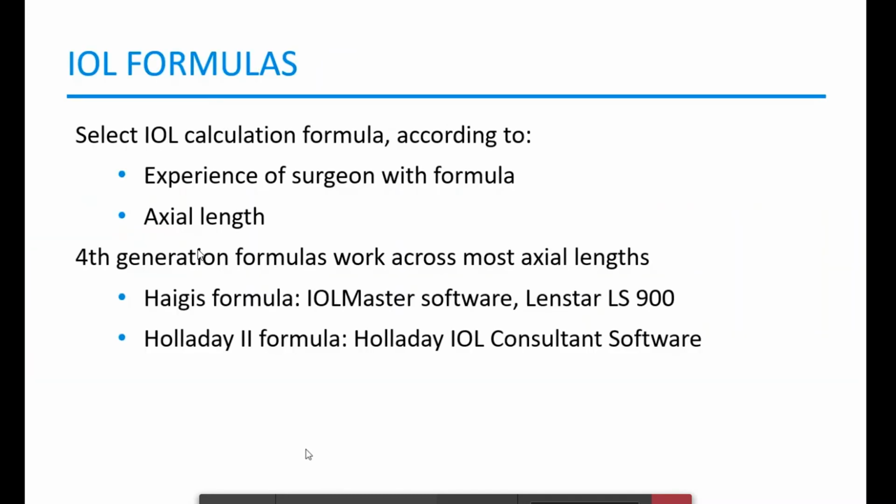So let's take a look at the formulas then. What are the formulas that are being used for calculation? The selection of the IOL calculation formula really depends on the experience of the surgeon with the formula. Some surgeons have a good level of experience with a certain formula. One of the common formulas, and it's still very popular, is SRK/T, and a lot of surgeons are still utilizing it.